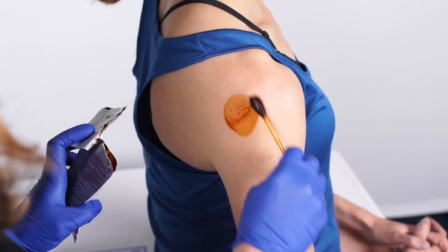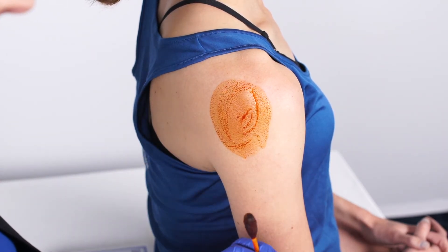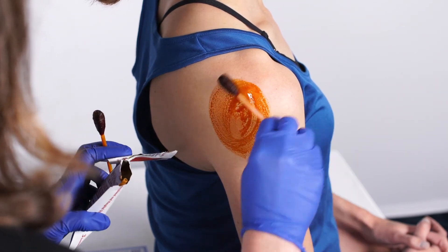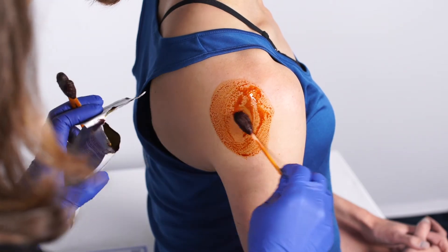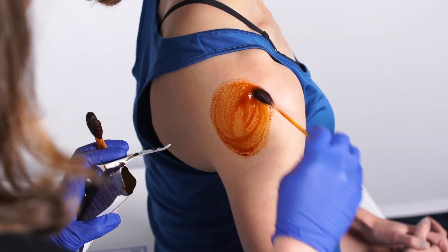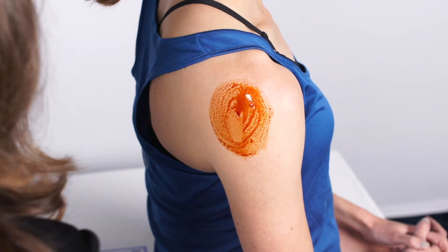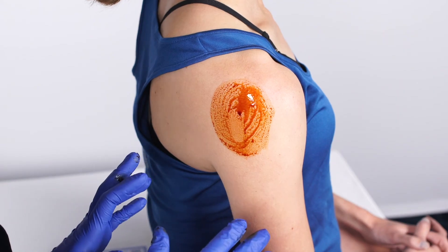Betadine sterilizes the skin when it dries, so it's important after you swab to give the betadine a moment to dry to really sterilize the skin. After the betadine swabs, I will open up a 4x4 and open up a band-aid to have that ready for after the procedure is done.